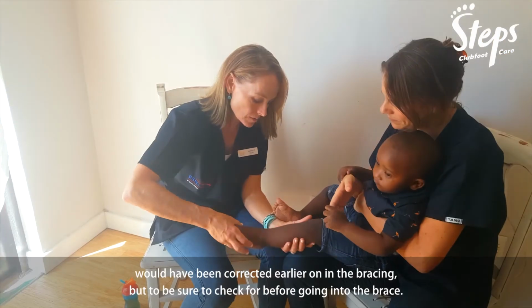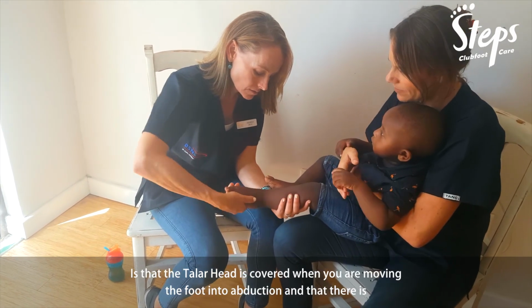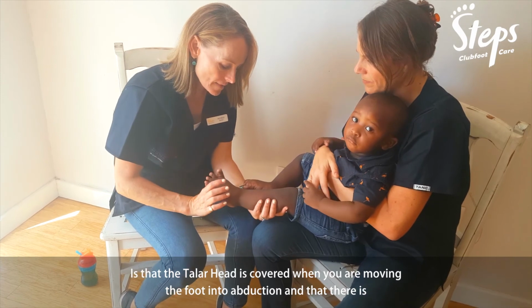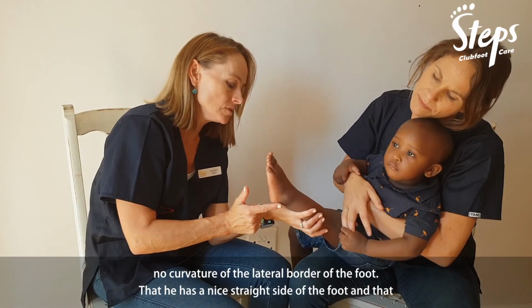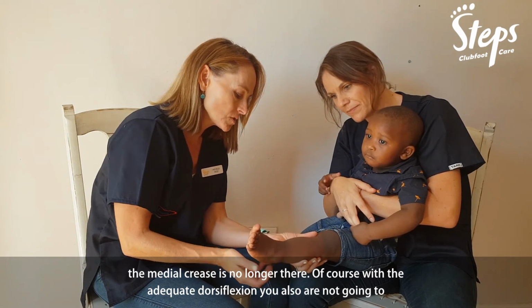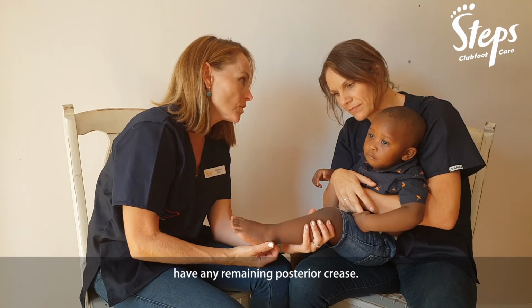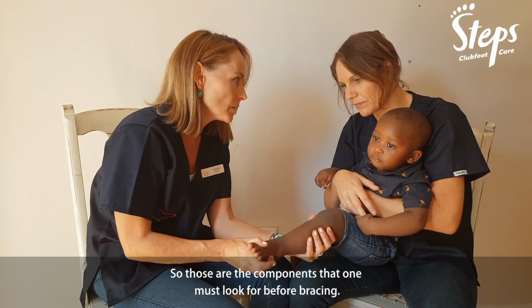going into the brace, that the talar head is covered when you're moving him into the 60 degrees of abduction, and that there is no curvature of the lateral border of the foot, that he has a nice straight side of the foot, and that the medial crease is no longer there. Of course, with adequate dorsiflexion, you're also not going to have any remaining posterior crease. So those are the components that one must look for before bracing.